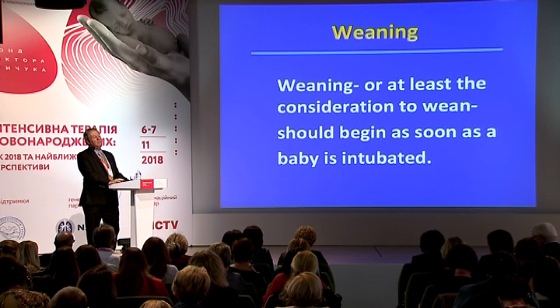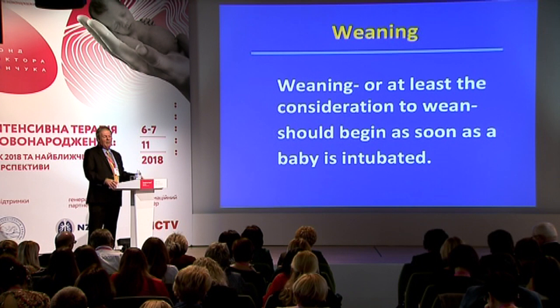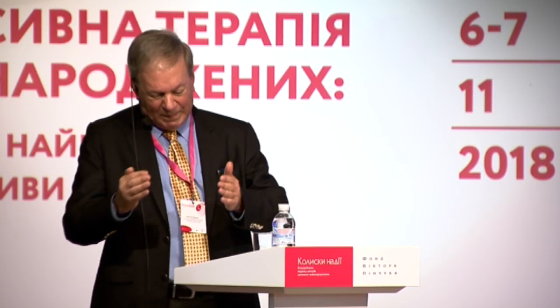Again, another common mistake I see by the inexperienced house officers is they have the baby on the ventilator, they get a blood gas, the blood gas comes back and it's normal. And the resident will turn to the nurse or the respiratory therapist and say, the gas is normal, no change. Okay? What he should be saying is, the gas is normal, let's challenge the baby and decrease the support a little bit. If you take the approach of the gas is normal, no change, the baby will be on the ventilator until high school.